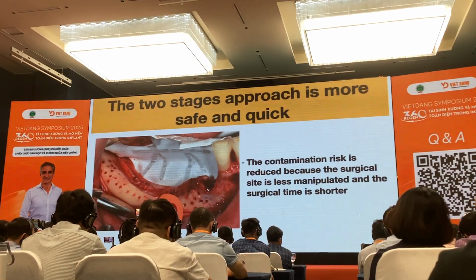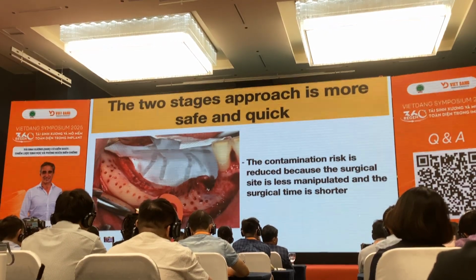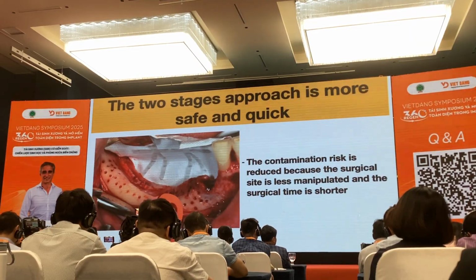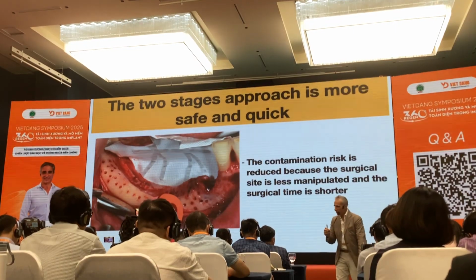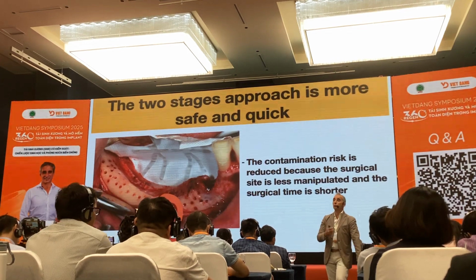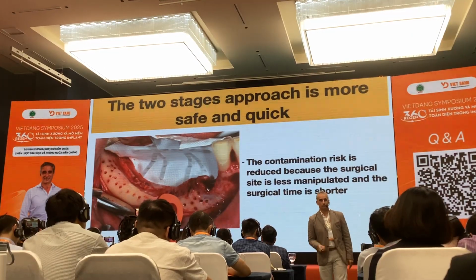But each time I have to perform a severe, challenging bone regeneration, 10, 8, 9, big horizontal defects, so when the biological condition of the site is less performing, I prefer the use of the two stages approach.